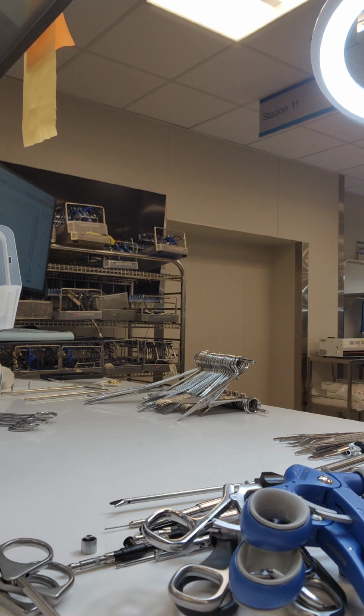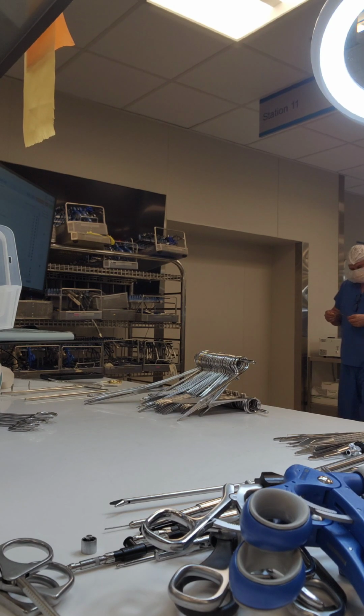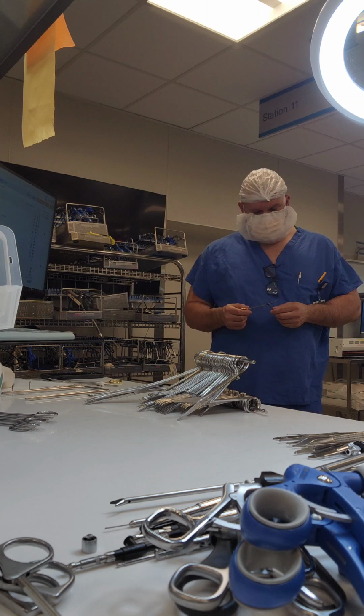What does your policy and procedure state about getting instruments out of your backup wall? Do you need to send that instrument to decon to get cleaned? In the manual, we're taught that instruments in the backup wall should be cleaned. I didn't do that here, right? So I went ahead, I got an instrument off the backup wall, and I just put it into the set. So what do your policies and procedures state about that? Again, that's time consuming as well.